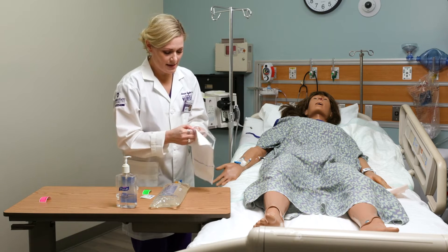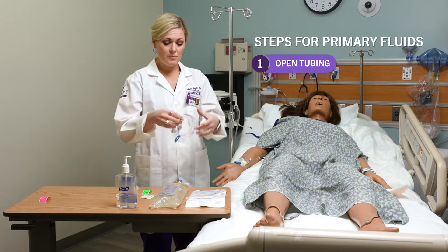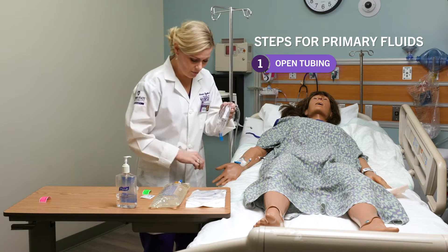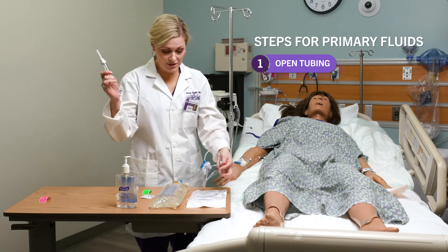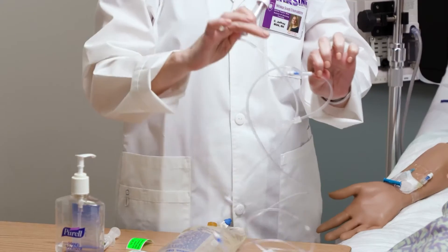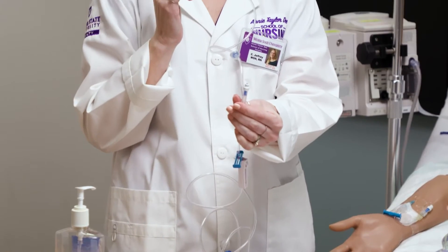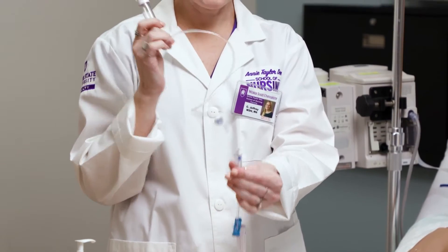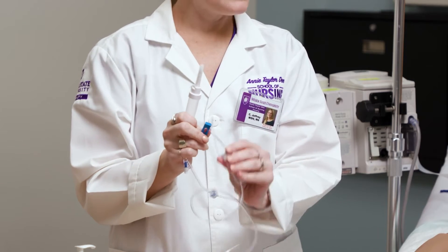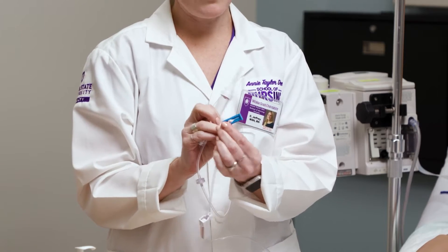I want to show you a couple of things on the tubing. If you've never worked with IV tubing before, it usually comes with a little paper tab — I'm going to throw that away. There are a couple of ports on it: one down here that will be closer to the patient, and one up here for our secondary fluids. There is a roller clamp down here that can be moved along the line, and there's also a slide clamp that just closes it off completely.